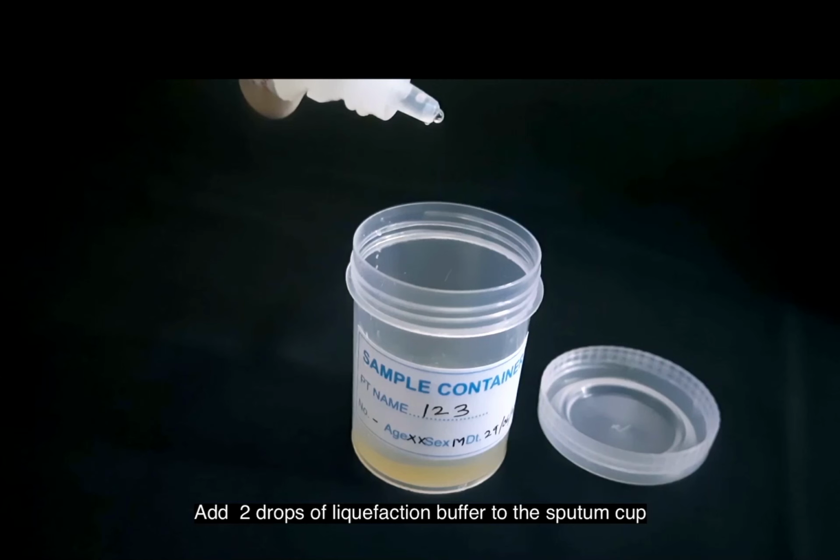Notice when you are putting the drop, this bottle nozzle should not come in contact with the sputum cup. You should not insert it. You should keep it at a certain height, a little above, then only put the drop. Why? If this sample is TB positive, and while bringing the sample the edges are obviously contaminated, and you touch this sample and then do the next sample also, the result may get carried over; the TB bacilli will go to the next sample. So the most important thing, when you put drops of liquefaction buffer, you have to put them from a height, and it should never touch the sputum cup.